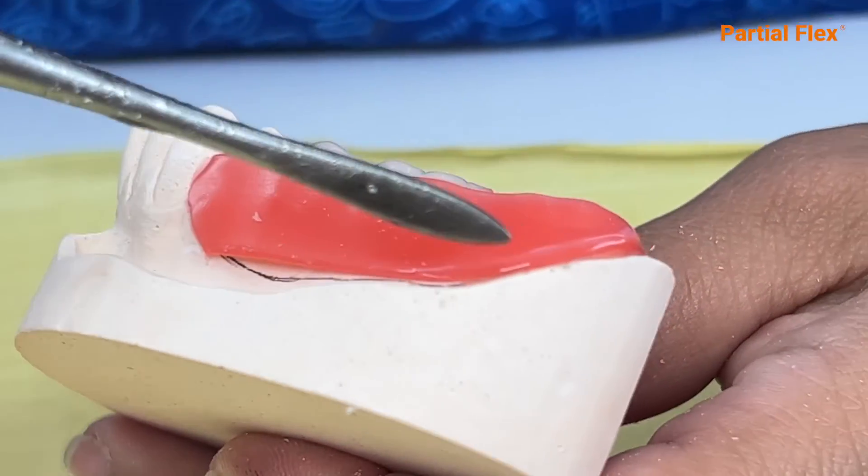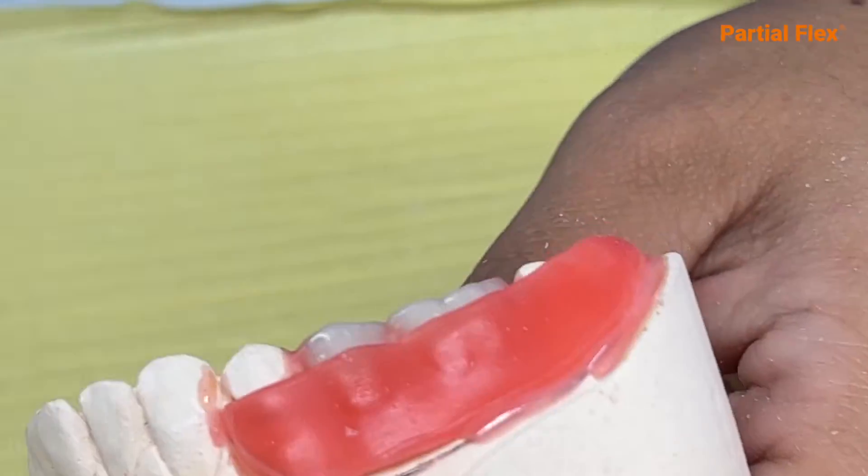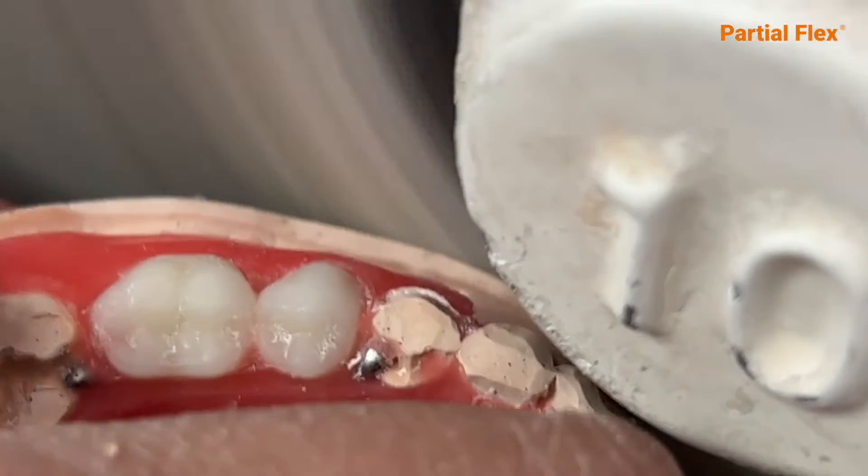Carry out your wax-up process and design your retainers. Trim the model as much for the neighboring teeth involved as for the restoration itself.